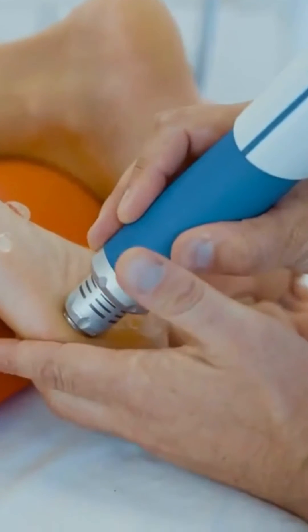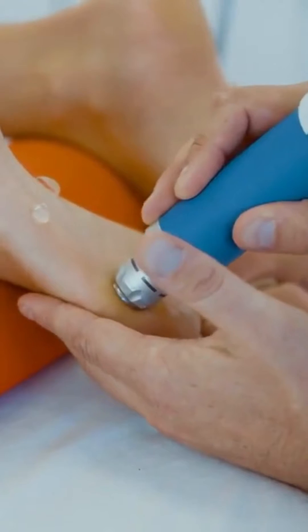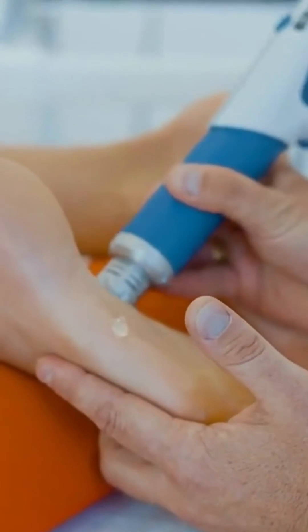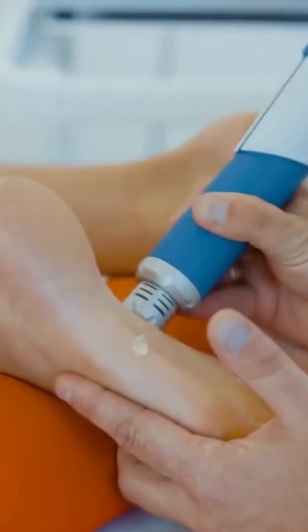Be sure to have placed enough gel on the tissue. Here we are applying the treatment towards the toes, but the gel is already positioned in the middle of the foot. This will enable a fluid treatment.